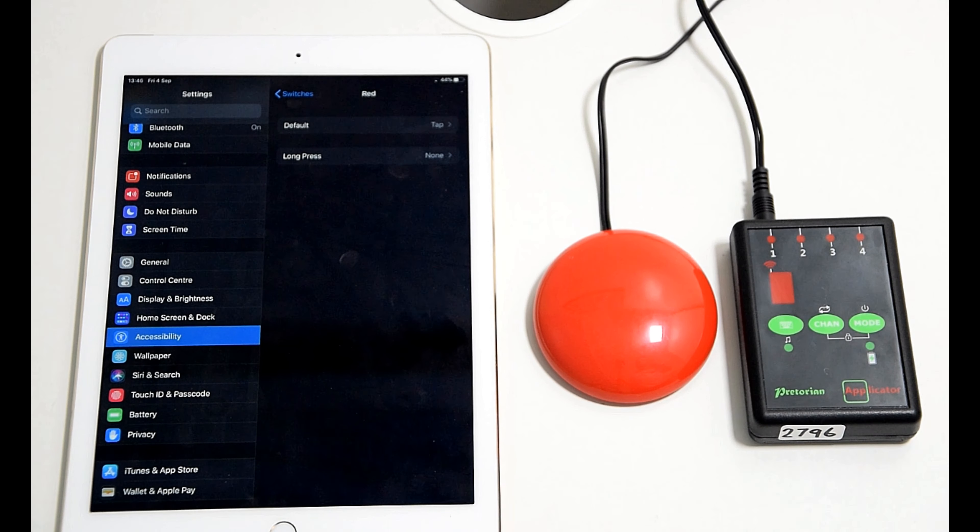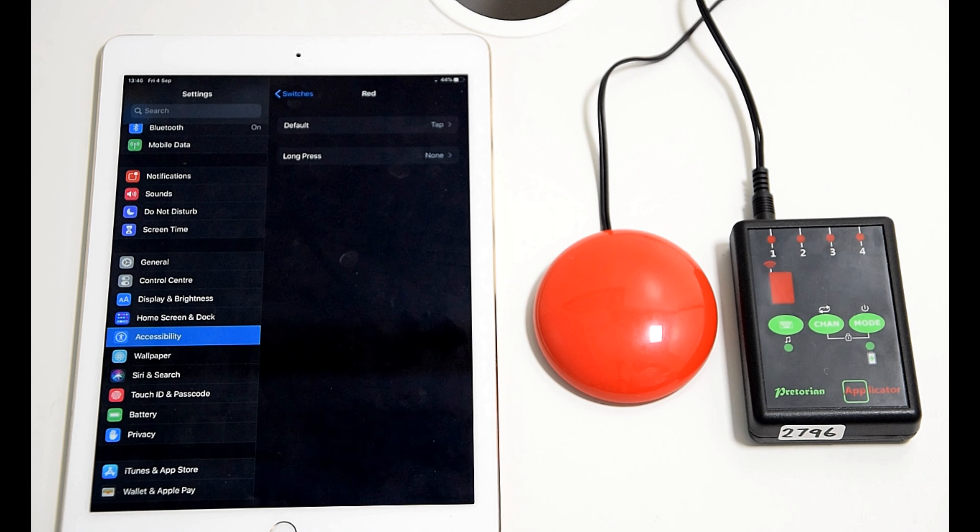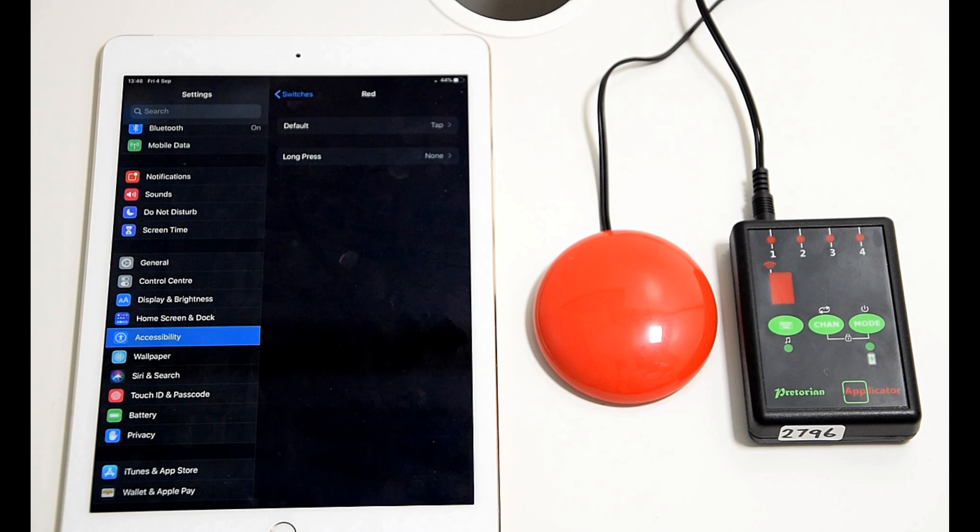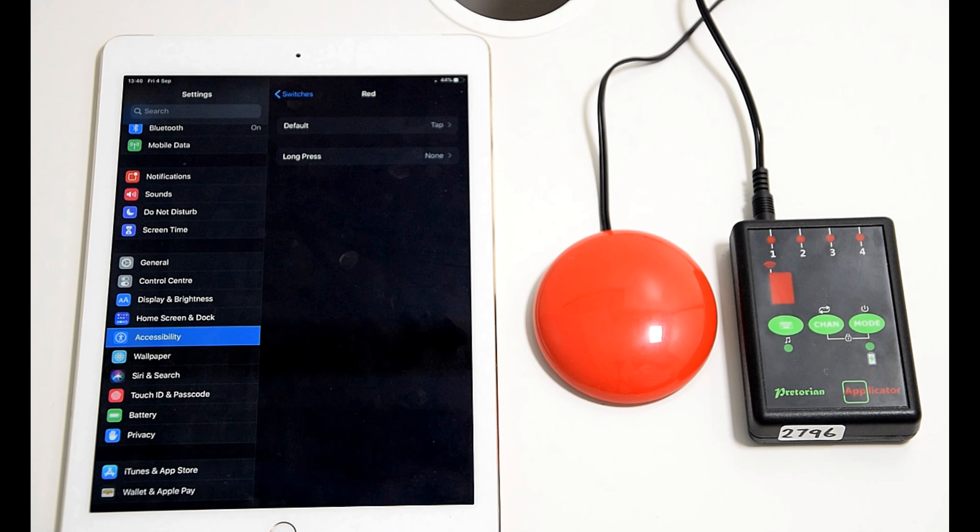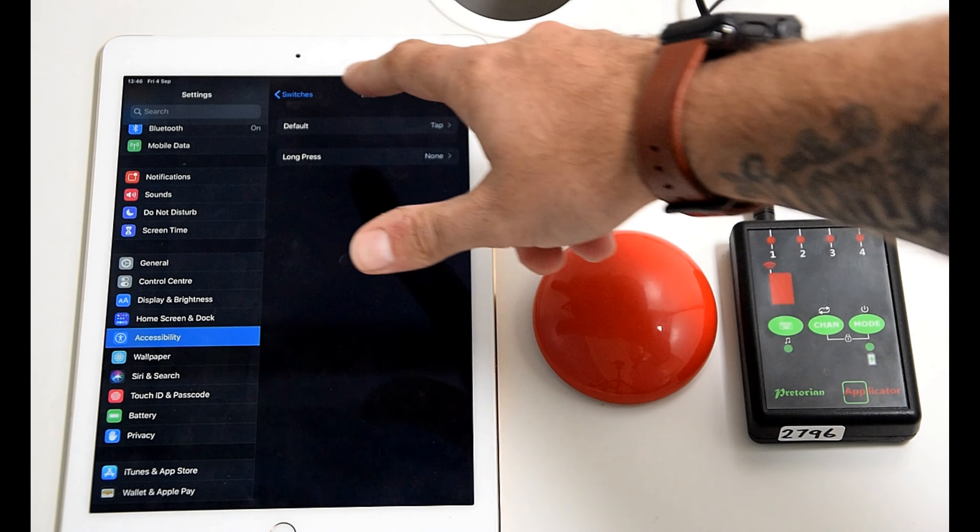This is because in the newest iOS, select item when you're clicking on an app brings up a separate menu. Tap bypasses that and selects the app for you. So have a play and work out what's best for you.